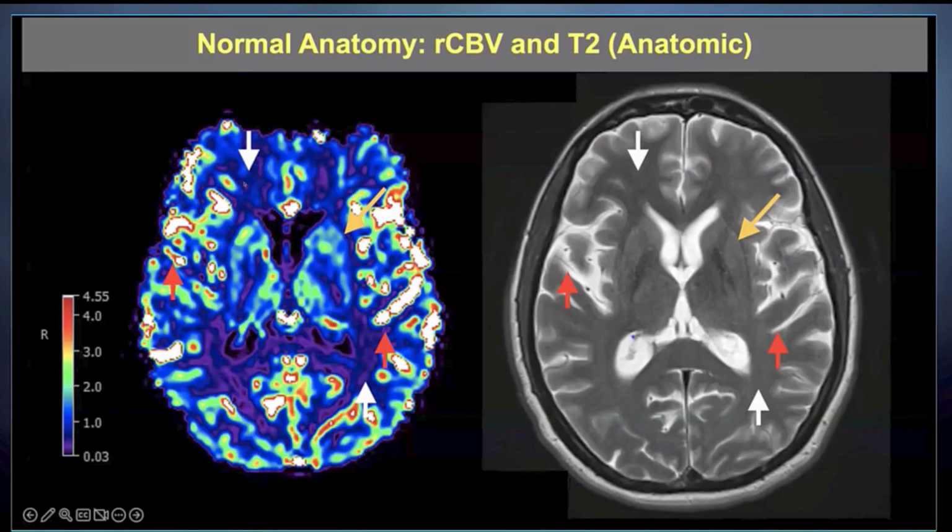And the reason why we need to do that is that even though DSC perfusion is supposed to be completely quantitative, it's actually what we call semi-quantitative, because there are some variations in measurements from patient to patient, and even within the same patient across different exams, because of differences in maybe the IV is not as good, or the actual contrast dosage.